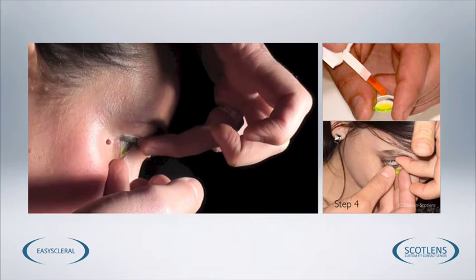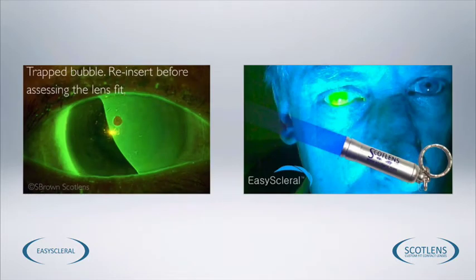Once we've got the lens inserted, we want to make sure that the fit isn't excessively flat where there's corneal contact or that we don't have a bubble trapped under the contact lens. This can be done with a blue torch. A quick assessment will give us an indication as to whether we can then get the patient to the slit lamp and perform a more thorough assessment.